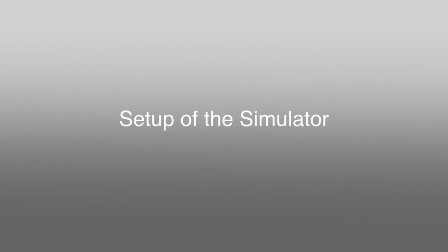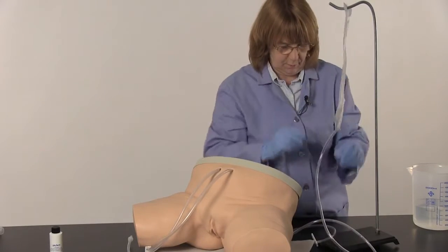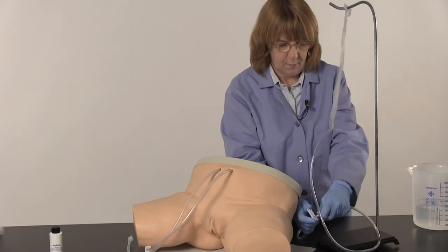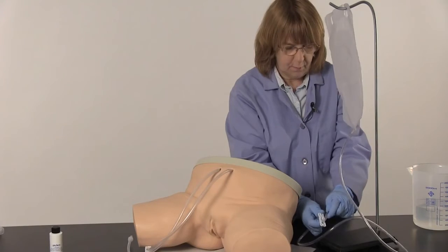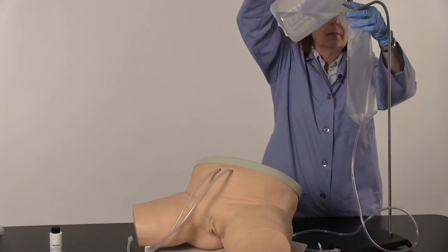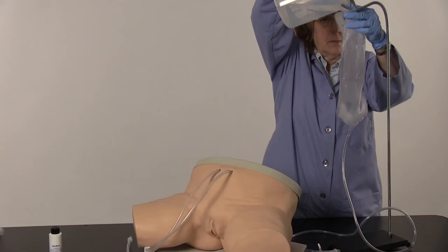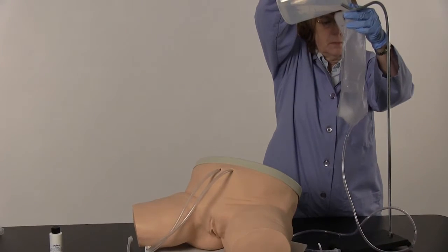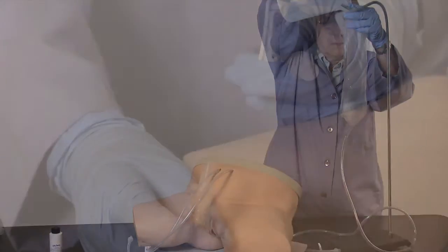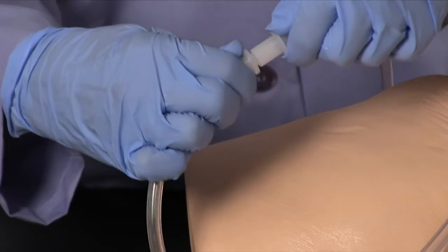Setup. Hang the fluid administration set approximately 18 inches above the simulator. Ensure that the slide clamp is closed and fill the fluid administration set. To extend the useful life of your simulator, NASCO recommends using distilled water. Using the quick disconnect fitting, connect the fluid administration set to the simulator.